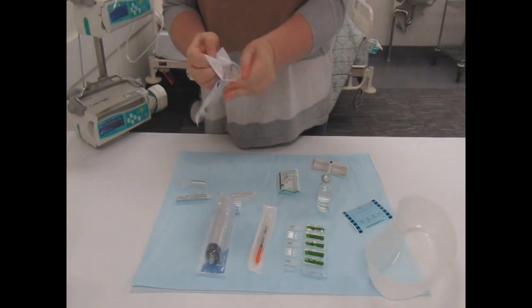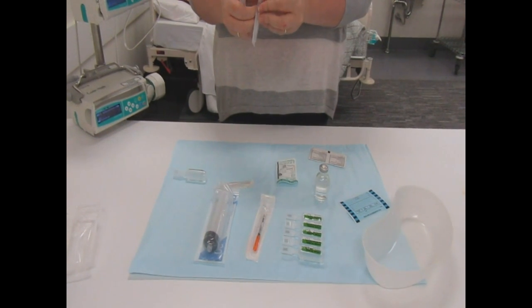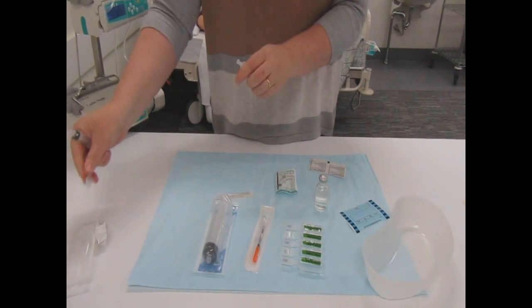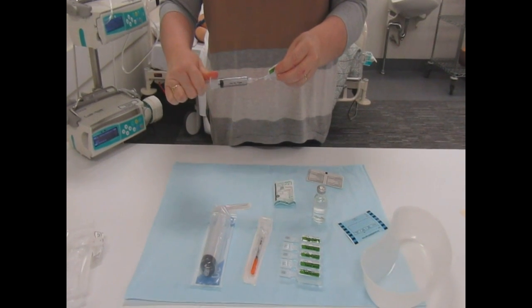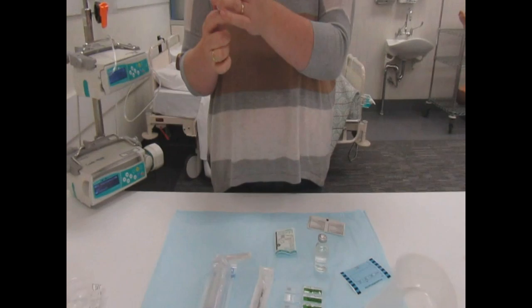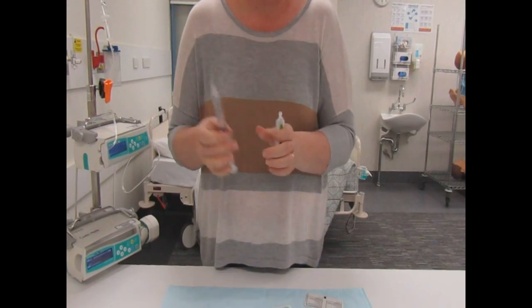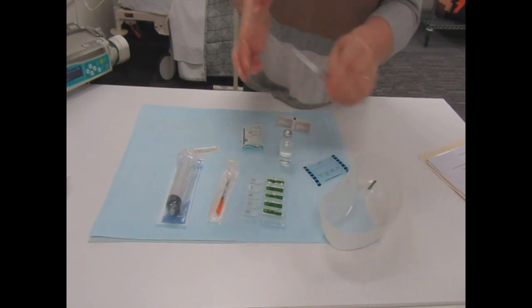My first step is opening my syringe to do the flush, which is just your 10mls. Remember to put on a drawing-up needle to do that — I'll put the cap aside because I do need to pop it back on. Once I've drawn up the 10mls — sometimes you do leave a little bit in the ampoule — I'm going to get out those air bubbles because we don't want those going into our patient. Then I'll carefully slide the cap back on and clip it into place.